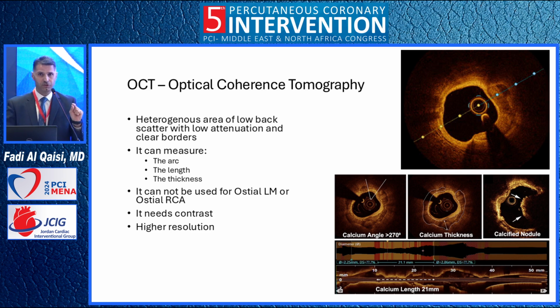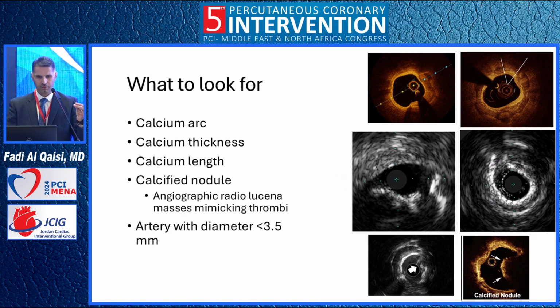It's not good for osteal because of the need of the use of the contrast and clearing the artery. So you cannot clear the artery for the osteal. And as you know, it needs contrast to clear the artery and get this nice black space, and you have to have good contrast washing, so it's not great for repeated use or for patients with chronic kidney disease.